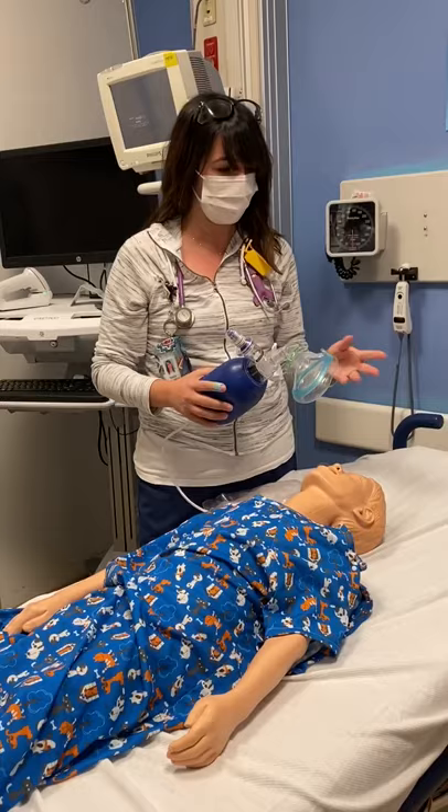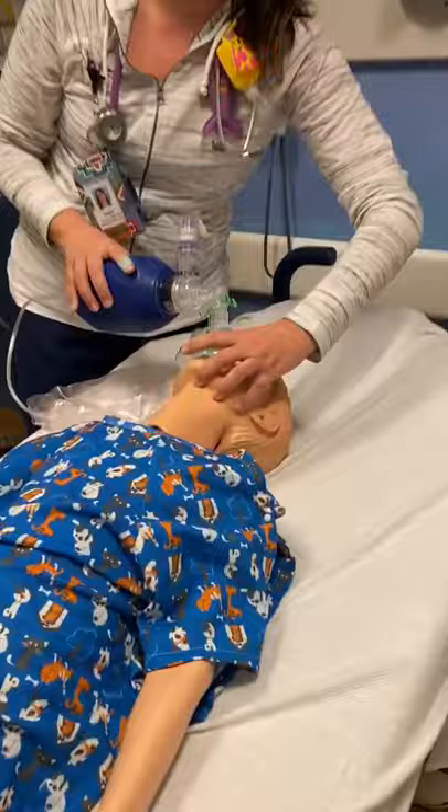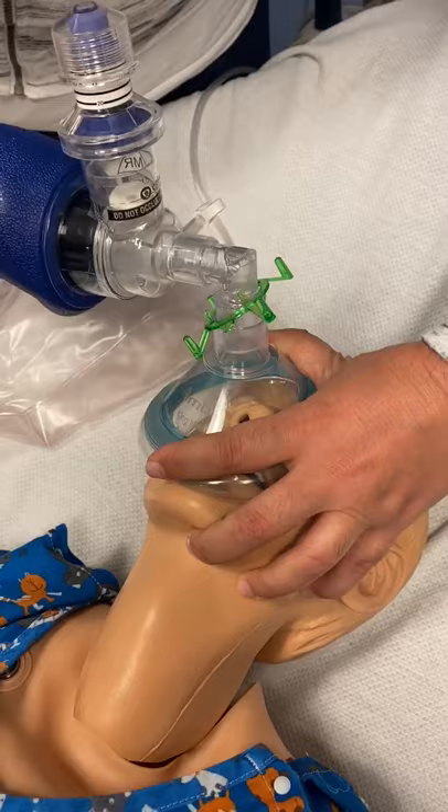Self-inflating masks work well when the mask is placed over the patient's airway, and air is forced into the lungs by squeezing the bag. The bag fills itself with air when it's released, allowing it to return to its original shape.